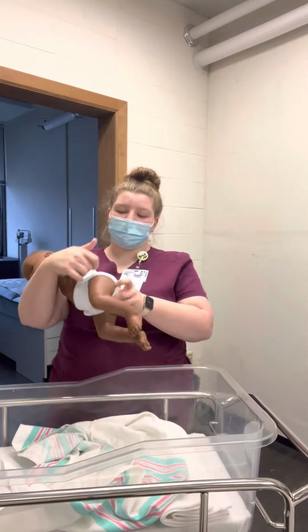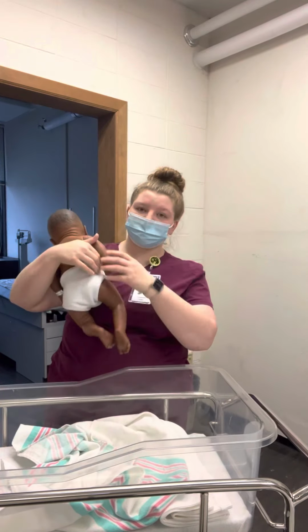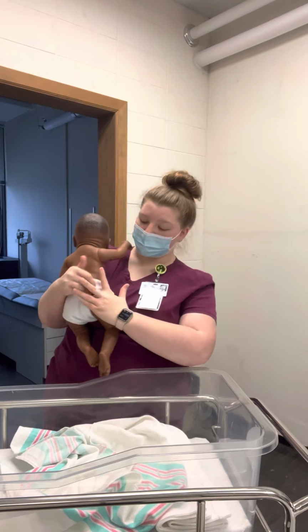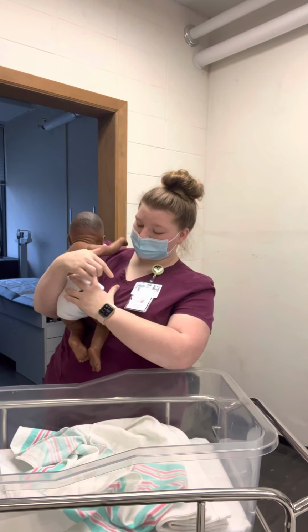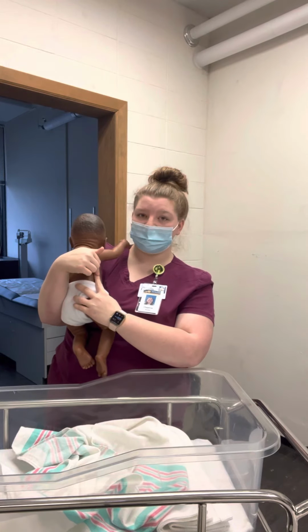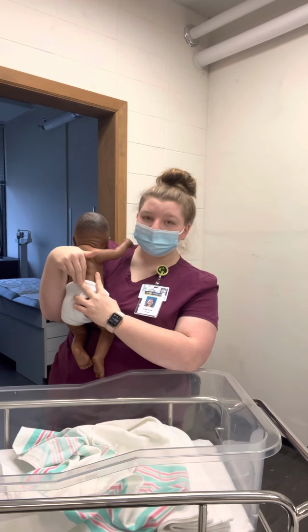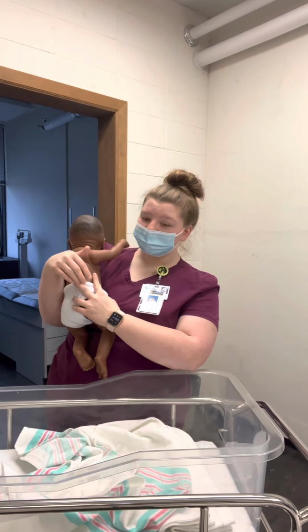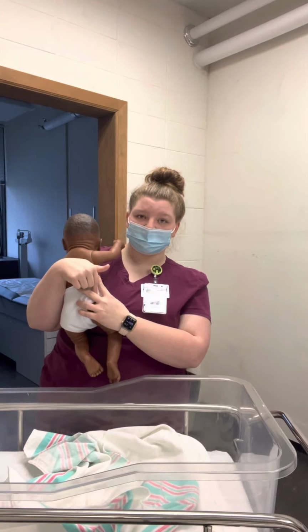For the ventrogluteal, you want to locate the greater trochanter and place the palm of your hand there. And then you're going to have your thumb toward their groin, the index finger pointed toward the iliac spine, and the middle finger pointing toward the iliac crest, and you want to give the shot here in the V.